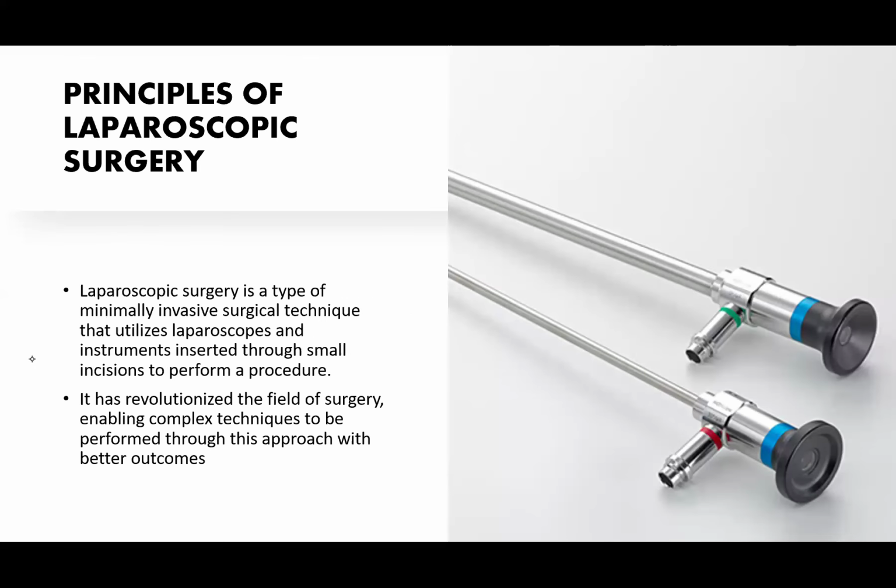Now, the general principles in laparoscopic surgery. All we've been saying is generally on minimal invasive surgeries, which we classify and give the various types and examples.